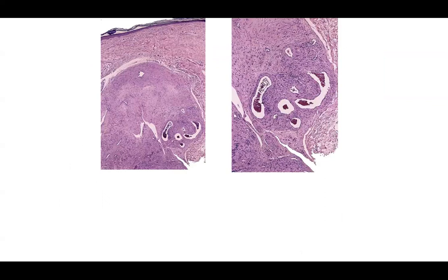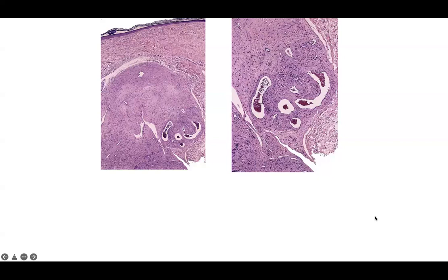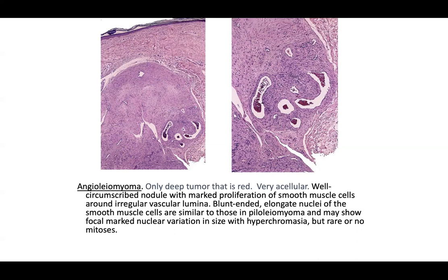We were just discussing nodules without epidermal involvement. You might get a slide without any epidermis, so recognize the pattern. Note the prominent vasculature and well-circumscribed nature of this neoplasm. If you had to guess the cell type, you'd probably say muscle. This is an angioleiomyoma — sometimes called the only deep tumor that is red — though it can be surprisingly acellular, looking eosinophilic with few cells.